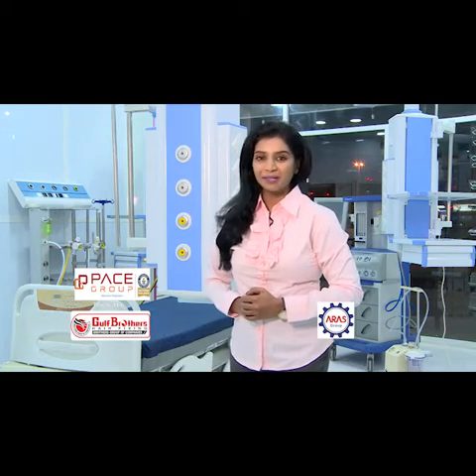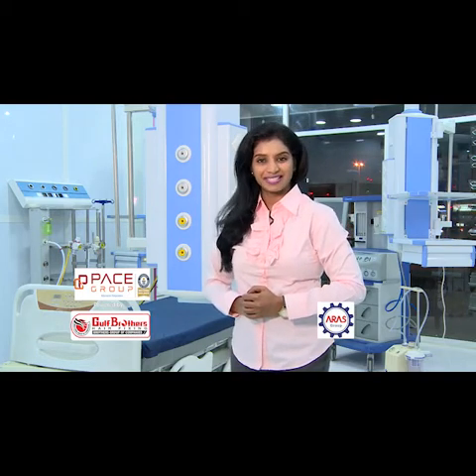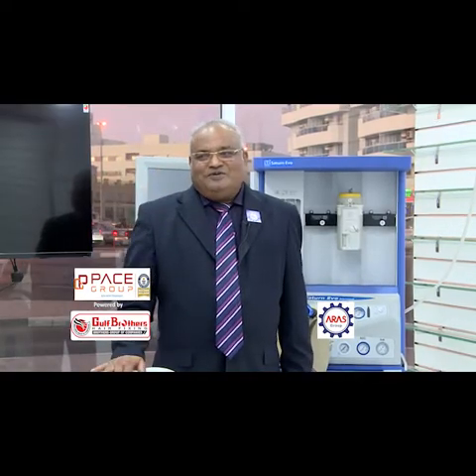Today we will be learning more about the operation theatre and recovery setup. Hi, this is Kc Babu. We are talking about the operation theatre setup and the recovery setup. After the operation, we need to have the recovery area. In the recovery area also you need facilities like oxygen, air, vacuum.